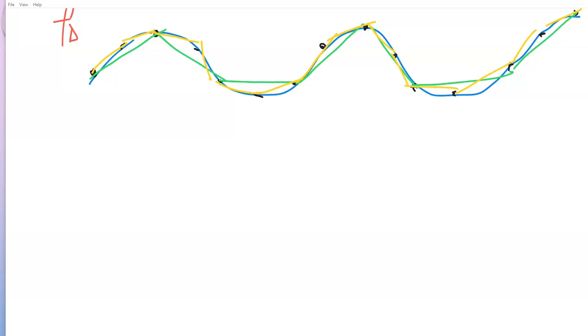Doppler. Now let's take an example of, let's say, a Doppler that's not quite enough. Okay, so here we have a PRF where it's not enough. And we're going to sample this Doppler frequency. We're going to sample it every once in a while. Okay, now when we connect those, we see that does not look at all like the original wave. Okay, that's because our sample rate was too low. So the actual sample rate has to be at least twice per cycle. So at least twice. So we're going to put in 2 per cycle.